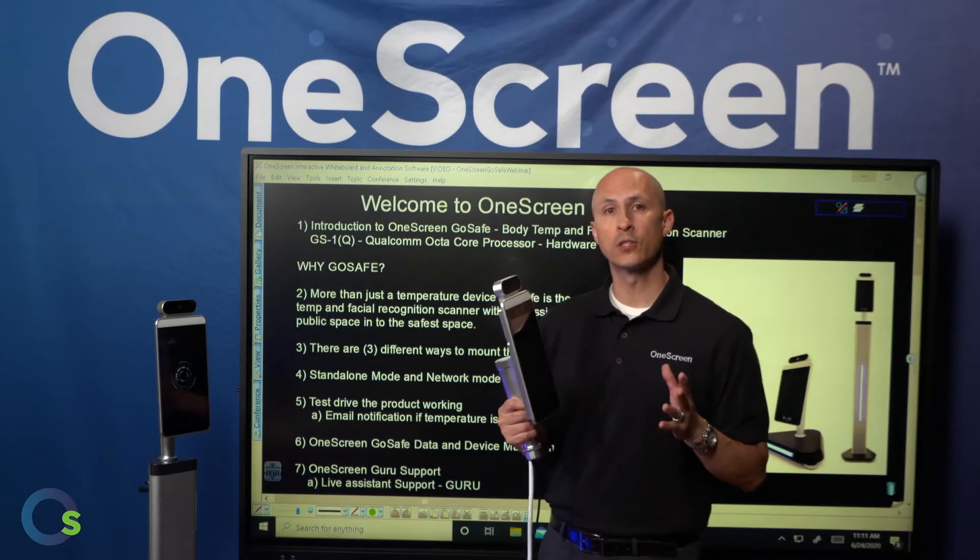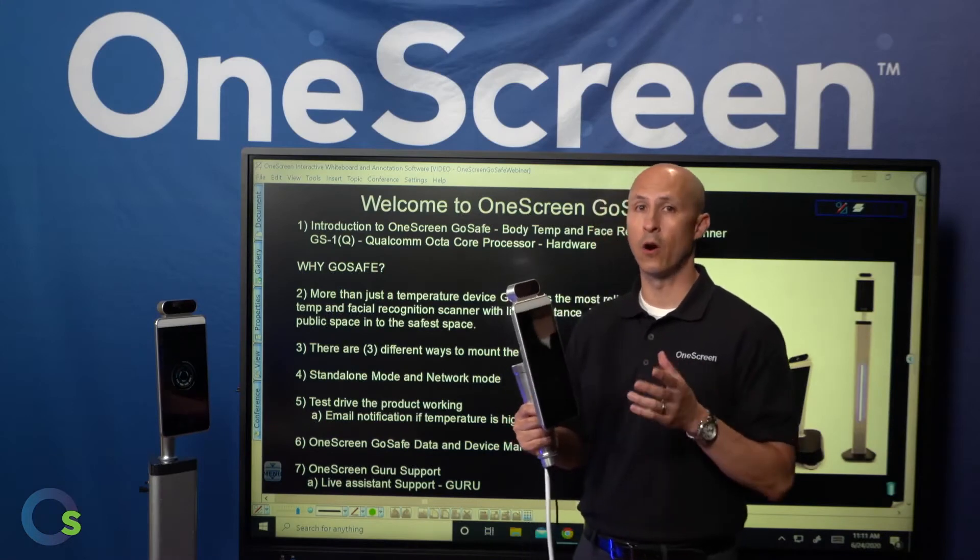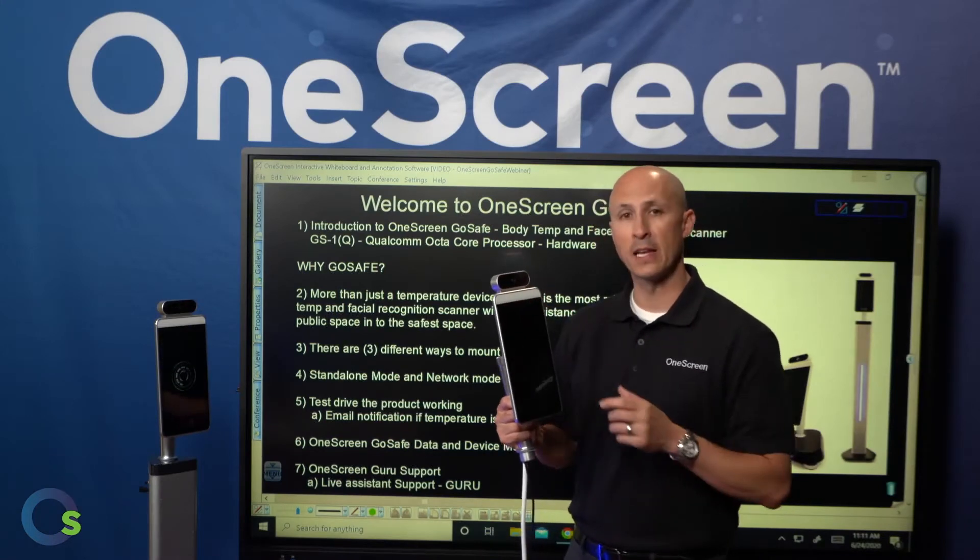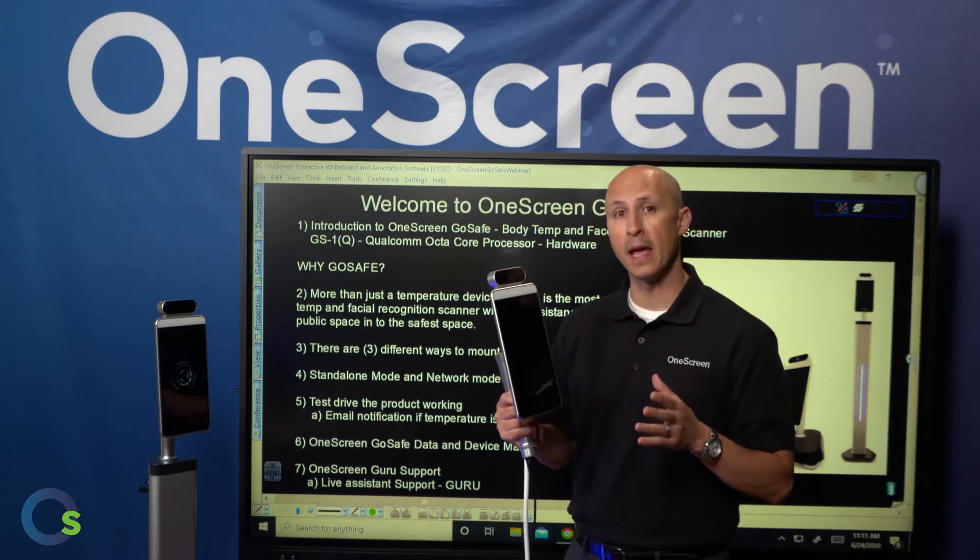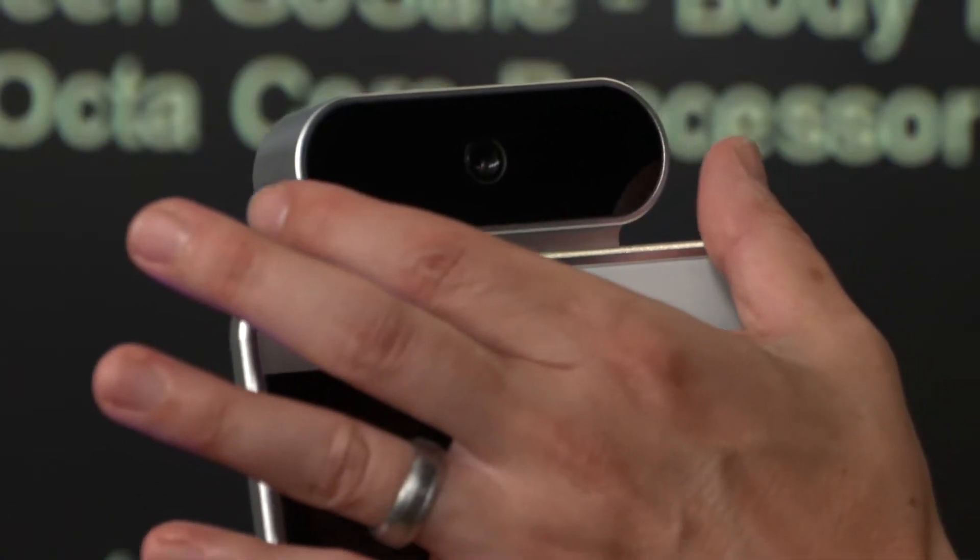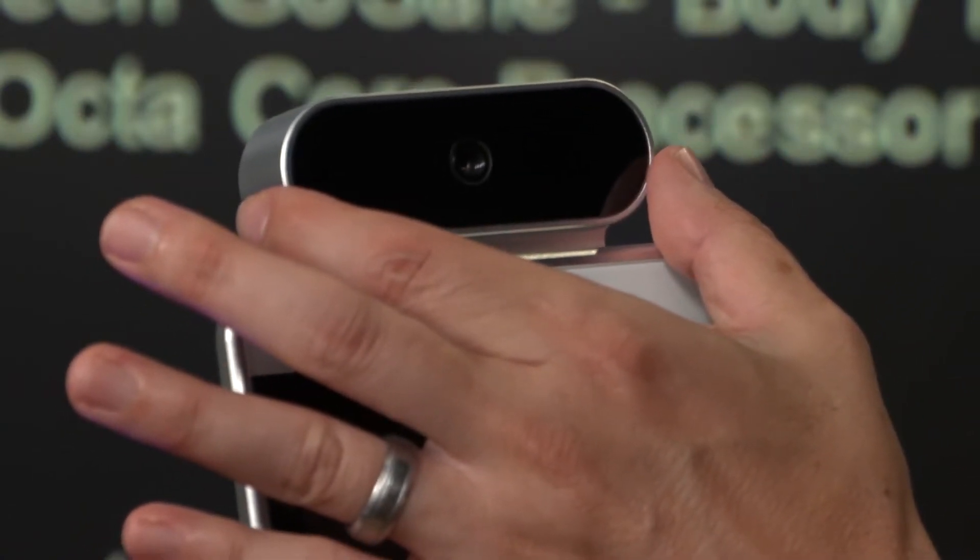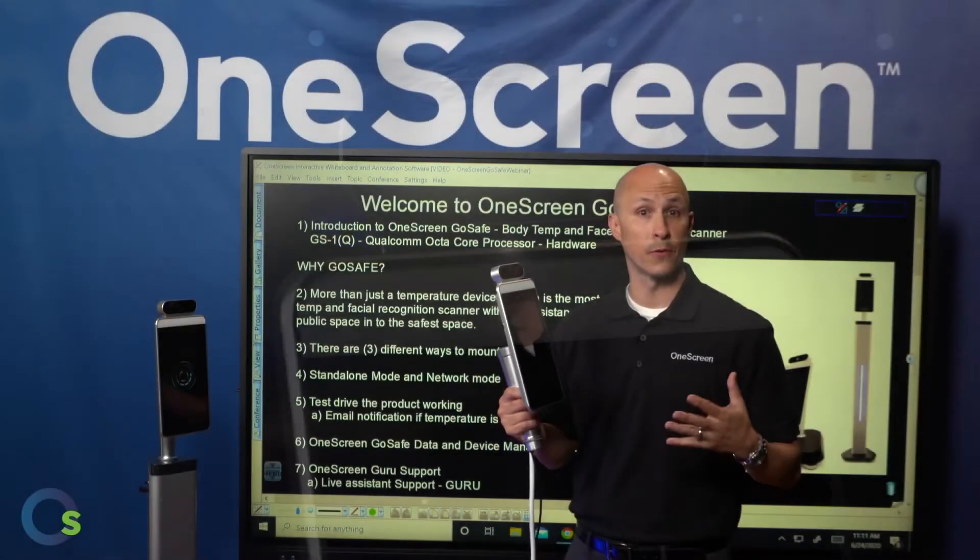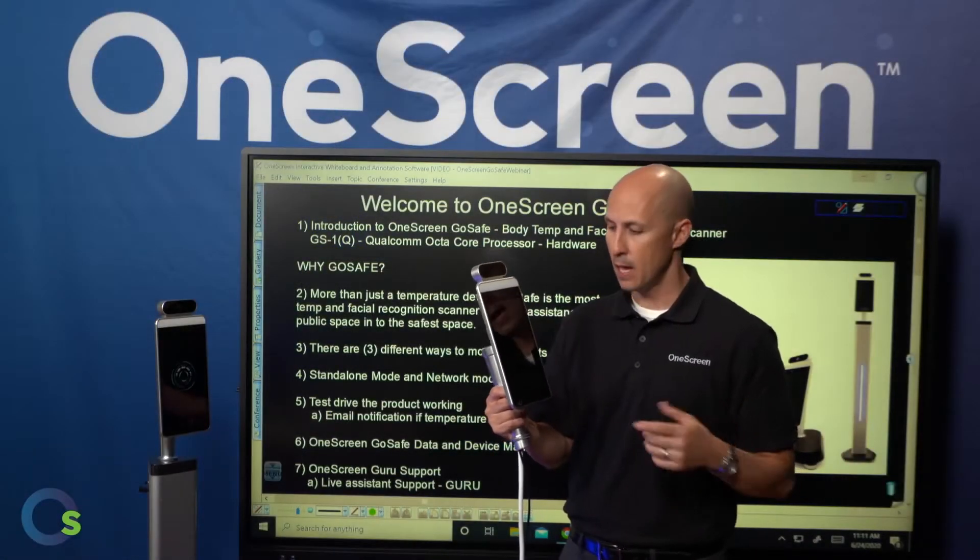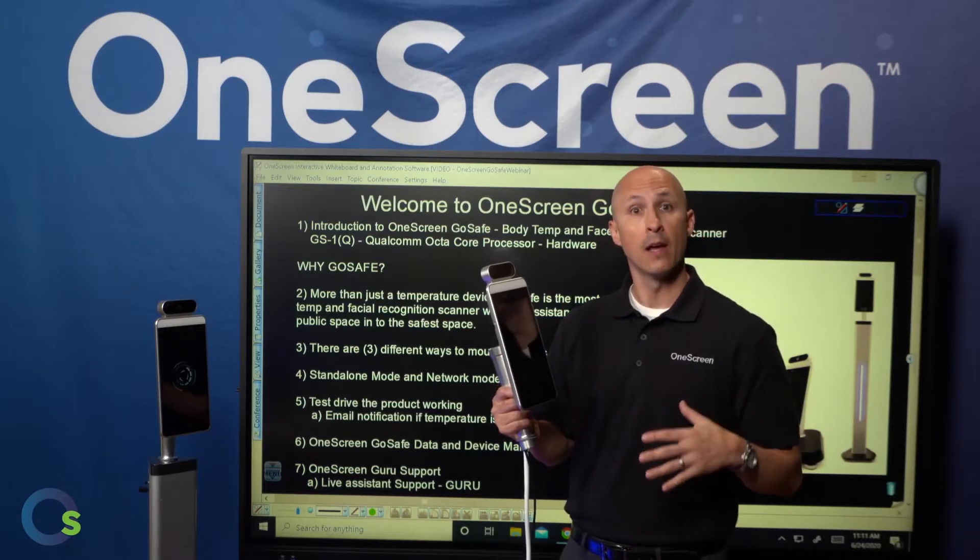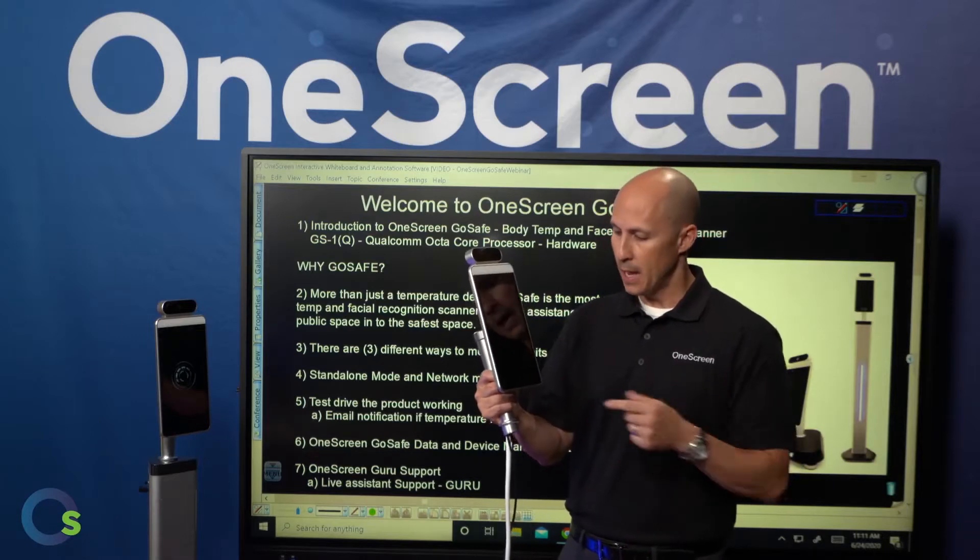Now let's take a look at the OneScreen GoSafe hardware. At the very top of the device, we have a Belgian-made thermal scanner that's scanning the temperature of your forehead. Additionally, we have built-in cameras for facial recognition, and we have an 8-inch display for visuals.